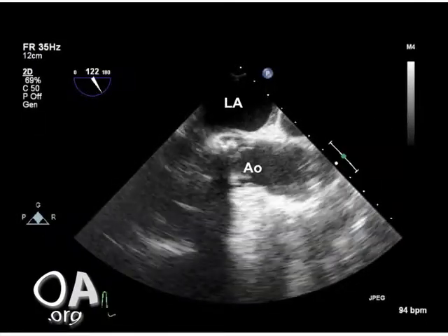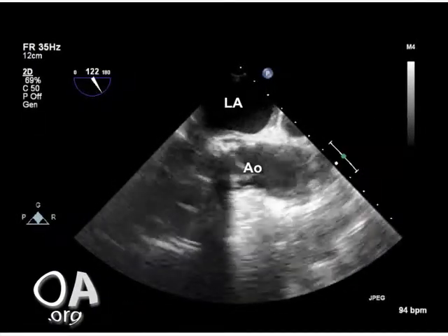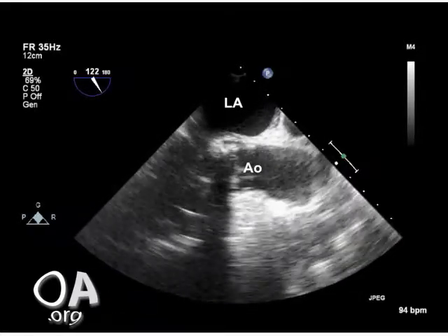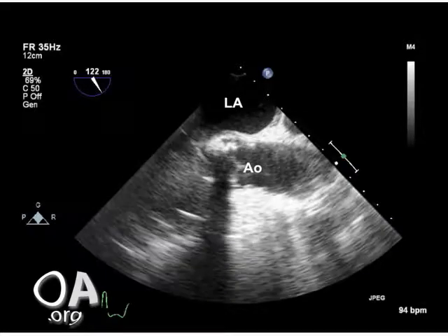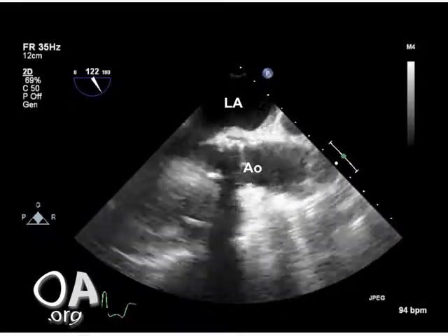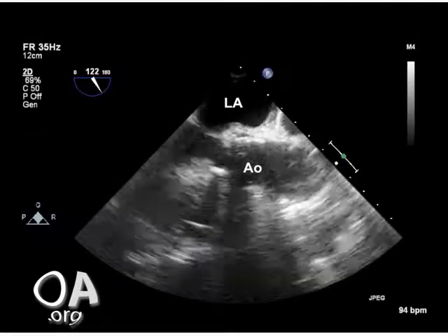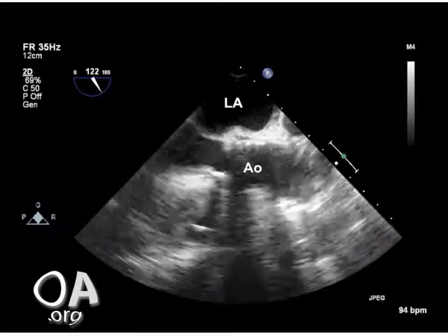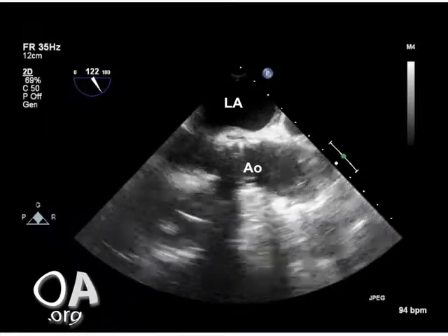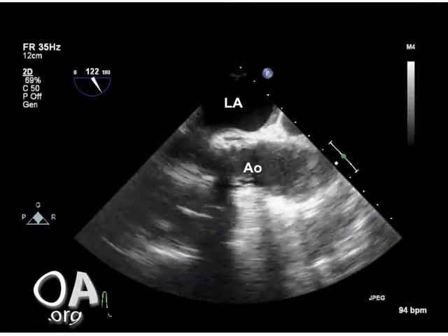This is another postoperative TEE for our patient. The view is a mid-esophageal aortic valve long axis view with the left atrium and ascending aorta labeled. Again, the new aortic valve is seen in the middle of the screen, this time in long axis, with appropriate mobility of the leaflets. The new valve does cause streaks and dropout artifact in the far field of this TEE image as well.